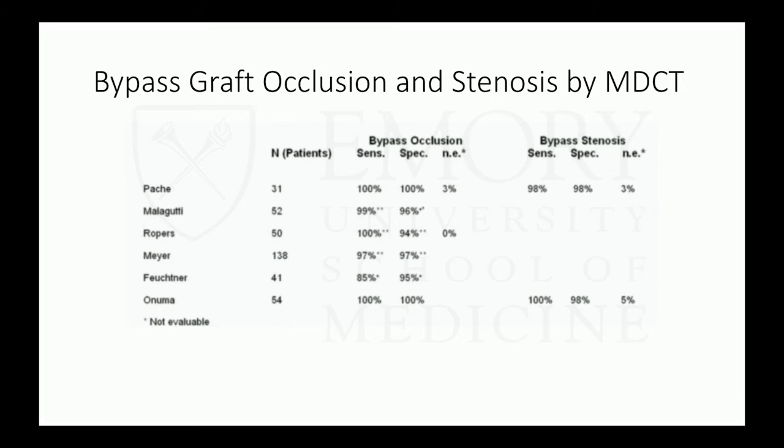They're referred for chest pain and a left heart cath. You're mucking around in the aorta for 45 minutes. You give them 200 cc's of dye, and you don't fully know their anatomy. I think this is really where CT can be very helpful.